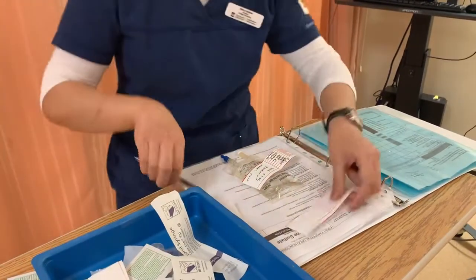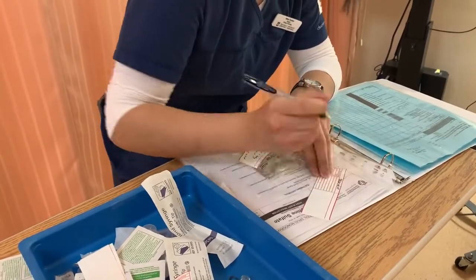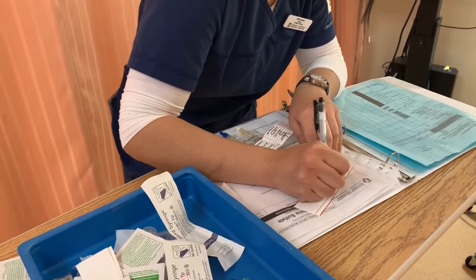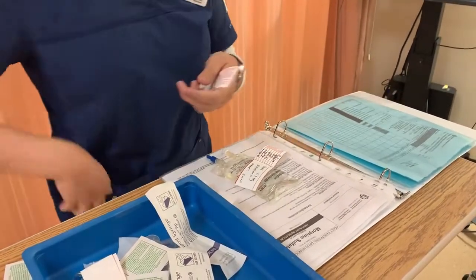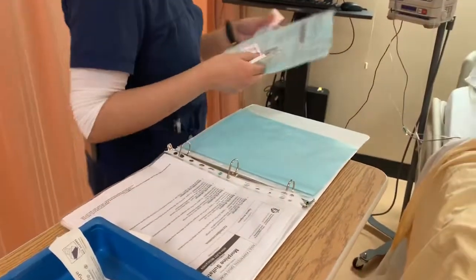I'm gonna make a label for my tubing as well. So morphine, and that would be the time today and the date, and I will sign my initials in there as well. So now we go to the patient's bedside. We wash our hands, we do our safety check. Patient's not in distress, bed's in lowest position, no safety hazards, and no fluid coming in.